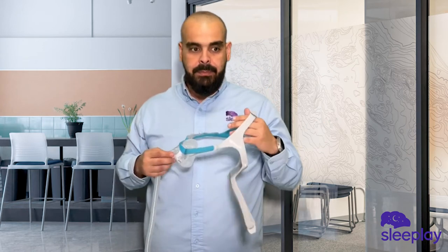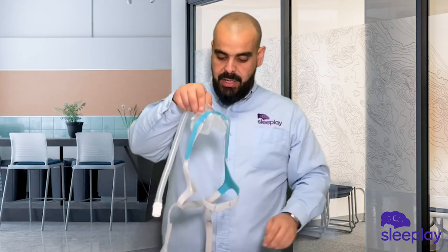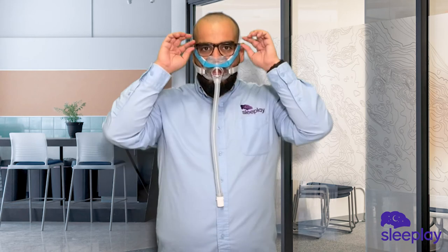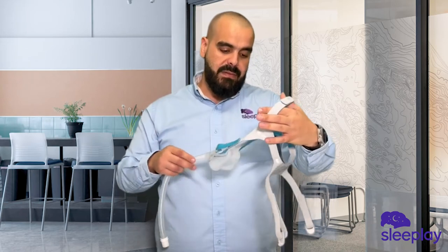I could even put on my glasses with the mask — let's try it out. For those of you that like to read in the middle of the night before you go to sleep, this is an excellent choice for you.